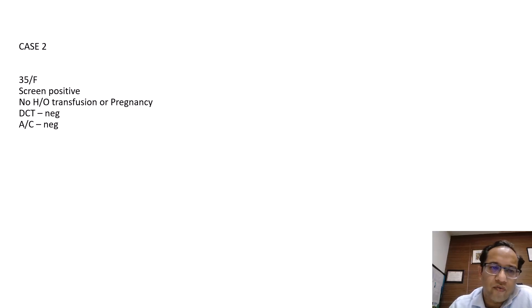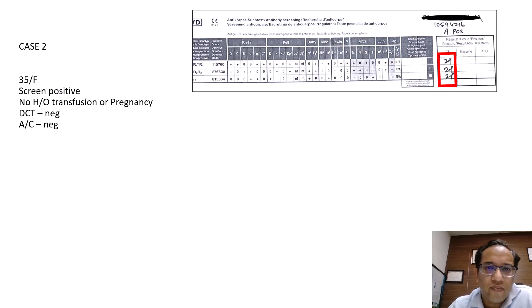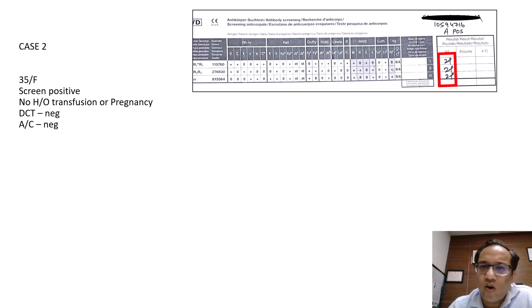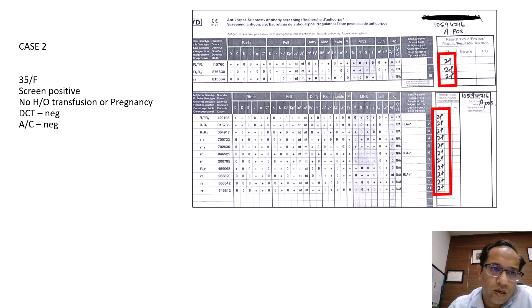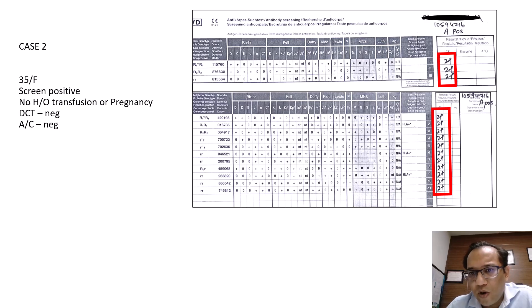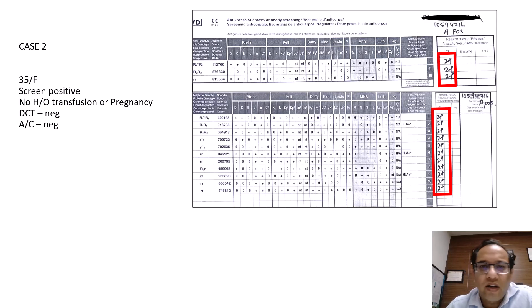Another case: a 35-year-old female with a positive screen, no history of transfusion or pregnancy. DCT is negative, auto control is again negative. We observed pan-reactivity and thought it could be due to some high-frequency antigen. Since the auto control and DCT were negative, we did not think of AIHA. We did the extended panel and found that all cells were positive with a reaction strength of 2+, confirming weak pan-reactivity.